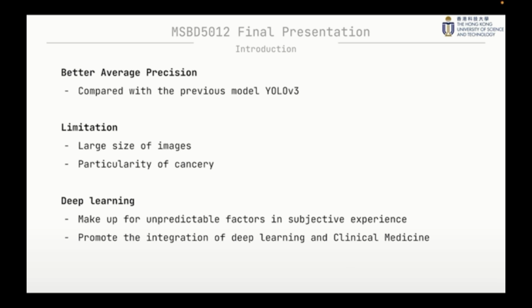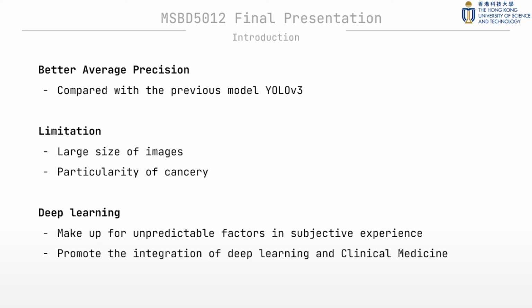Supervised learning needs to locate the cancer cells carefully in the images, while the cost of obtaining labeled data is relatively high. Pathological image recognition in artificial intelligence still has very large upside potential.